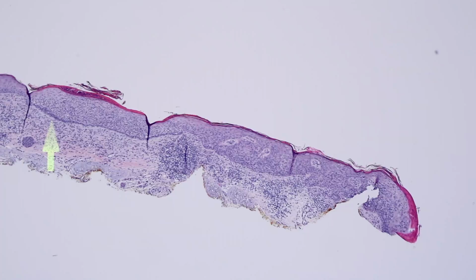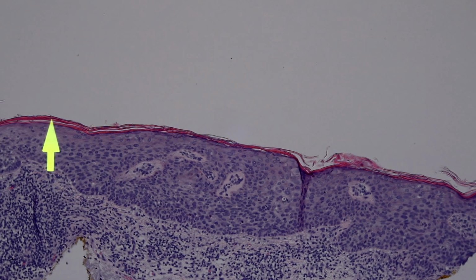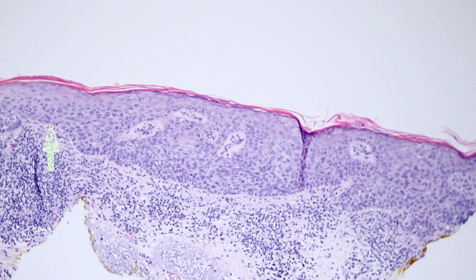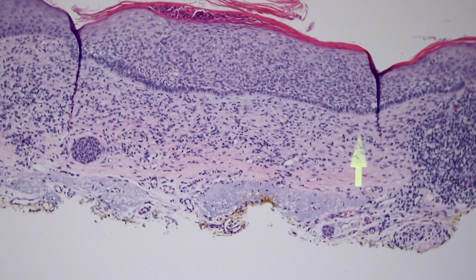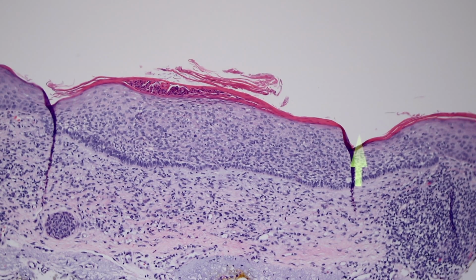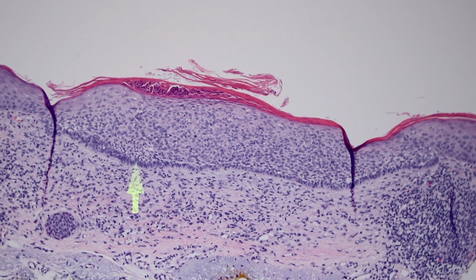Now this is kind of an interesting one because it gives us a chance to look at two other lesions that sometimes can get confused. This is squamous in situ with full thickness atypia, but there you can see there's atypia and a little bit of pagetoid spread here and there. But then right next door, this is not squamous in situ. This is a superficial basal cell carcinoma. I think the nice basal palisading can be helpful, but sometimes that basal palisading can get confused with an eyeliner sign. And also I've seen times where really early superficial basal cell carcinomas can look kind of like actinic keratosis.